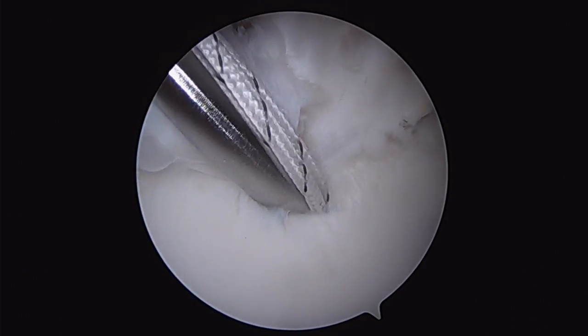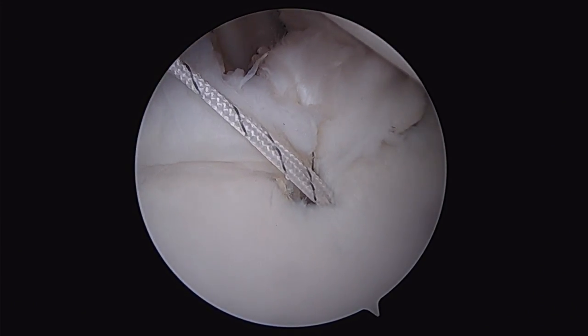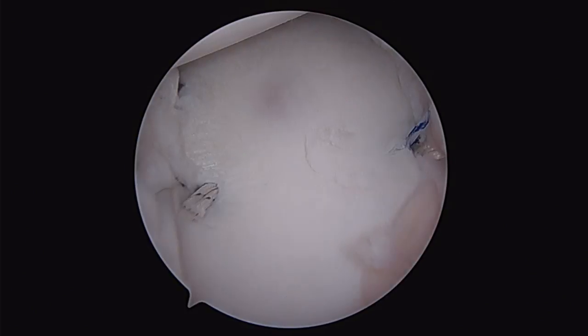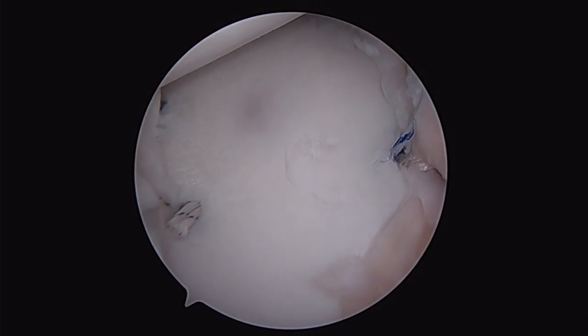Posteriorly, we carry the same process out with two 1.8mm anchors to achieve an excellent capsular shift, for the purposes of accomplishing our labral repair and reducing the significantly abundant capsular volume that we saw at the beginning of the video.